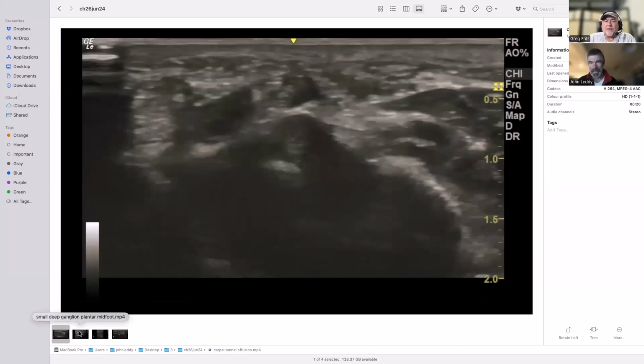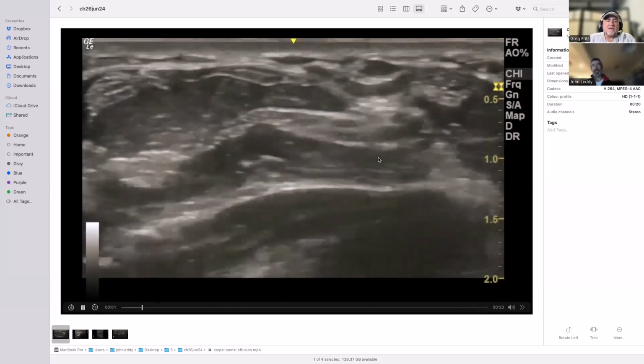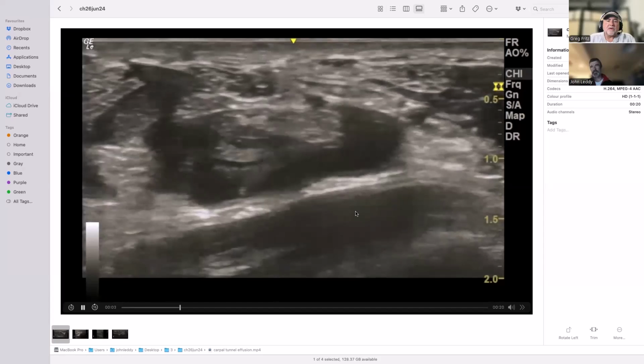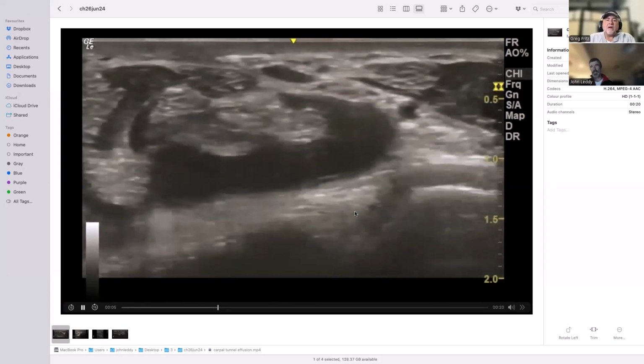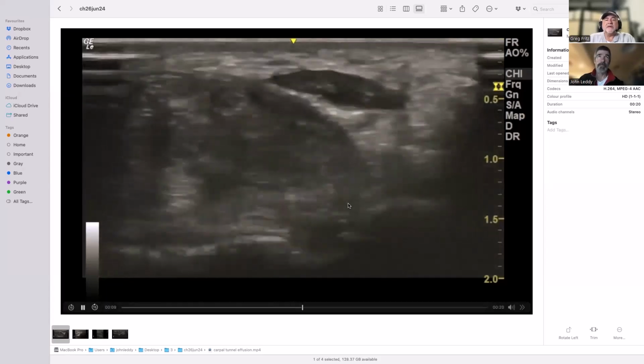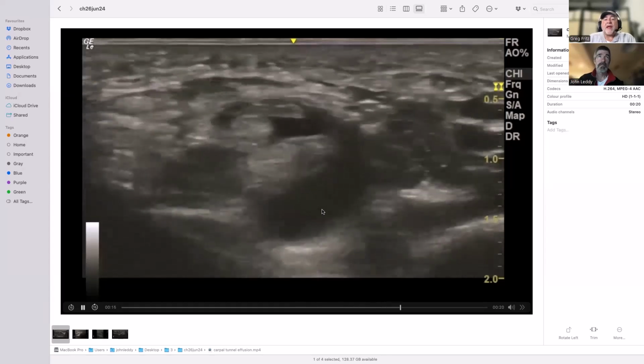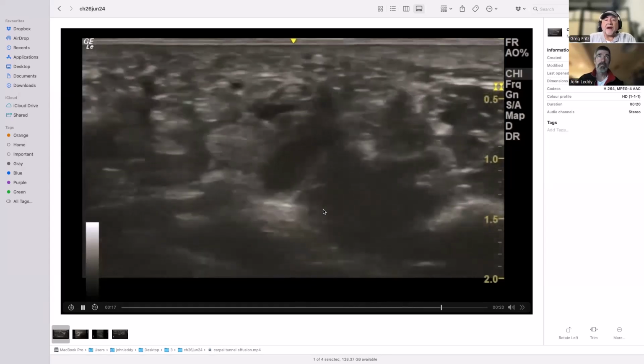How would you narrate this pathology? If this was a patient who I saw in clinic, I wouldn't have had to narrate very much. This is something I would have just put a needle in and sucked the stuff out, and maybe dropped a bit of steroid in there to see how it went. You would expect them to be quite pain improved directly.